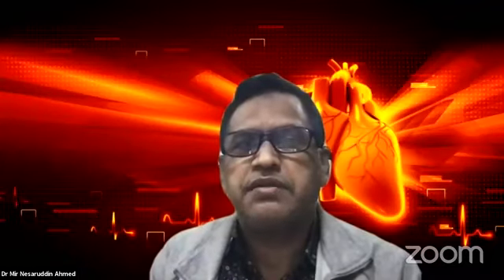An interesting question for all the panelists here, a bit of a funny question. Nowadays it should be answered by a radiologist and not us, but still I am asking. Lots of X-rays are coming with the comment of cardiomegaly, and when you do echocardiography, the dimensions are all within normal limits. But the X-ray is going, so what is the trick here? Sir, the trick is this, sir. It is taken in the expiratory phase, sir. In doing an X-ray, the patient is asked to hold the breath in inspiration.